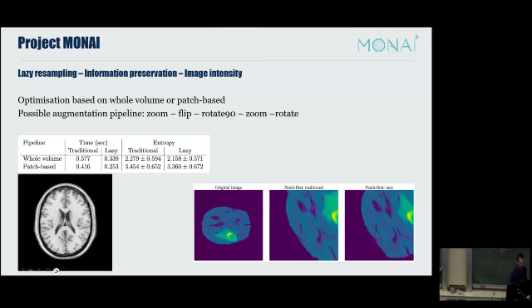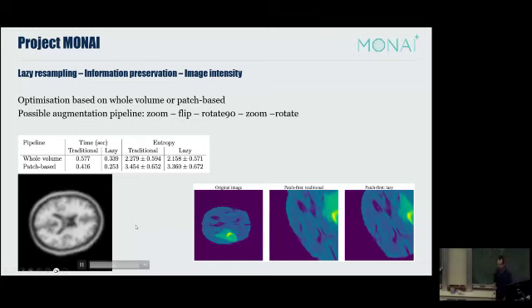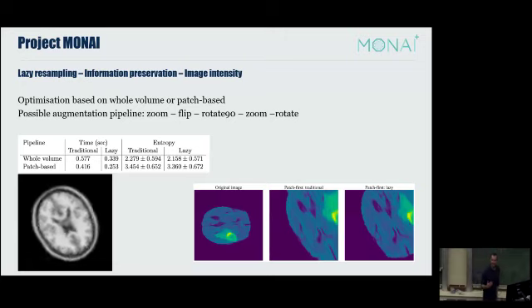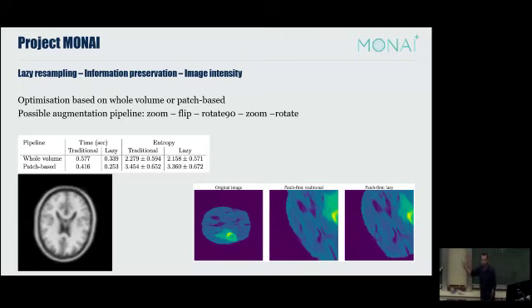Just to illustrate, I'm going to click on this image. This one is just to illustrate the concept of resampling to an extreme. That's never the case. But I'm going to take this image, apply a 5-degree rotation, take the result, 5-degree rotation, take the result, 5-degree rotation. And this is what I obtained. Sorry, the other way. You can see that I'm blurring my image. And what's happening by blurring is that it's obvious that something is not ideal. But it's not to this extreme, because we don't do 100 of these resamplings, but it still has an impact.